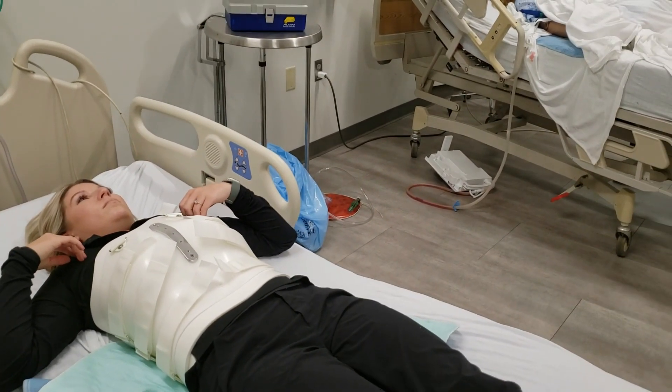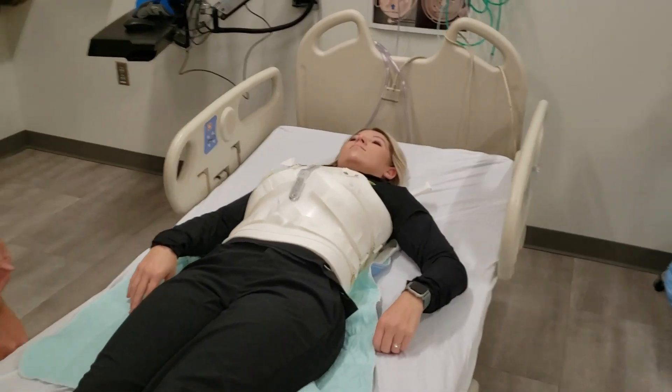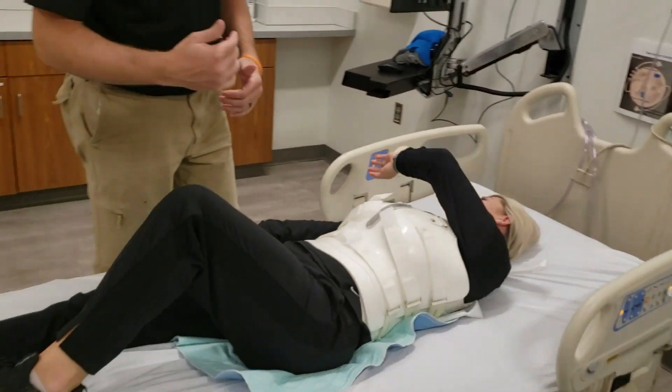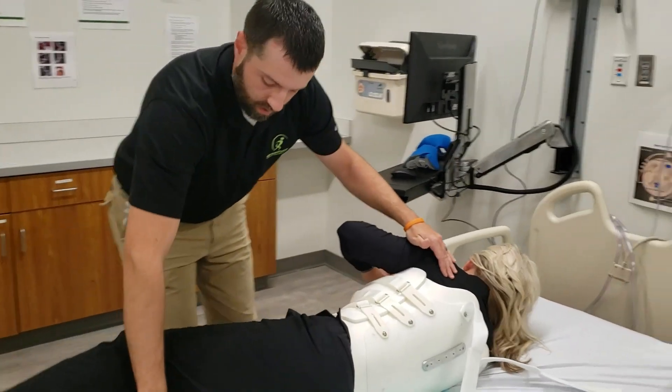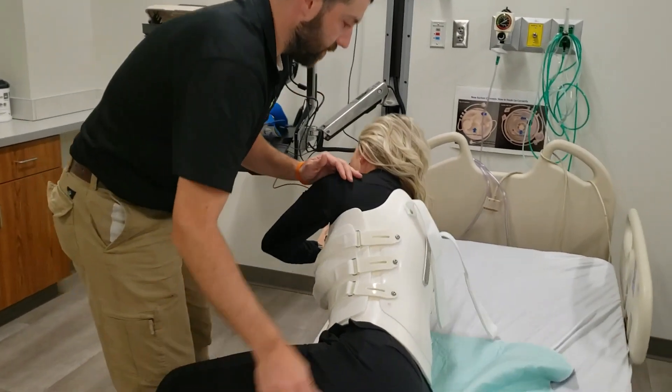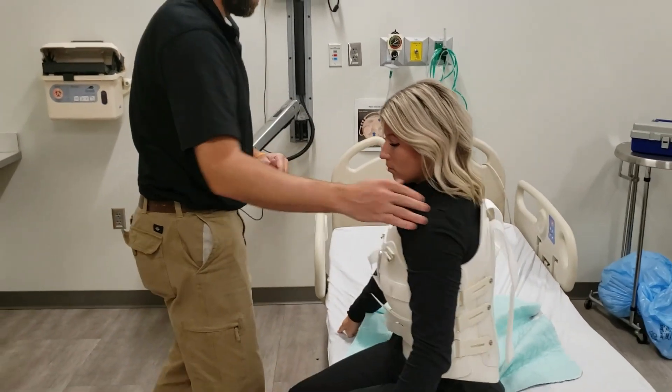Once that is fit, we will have the patient log roll again and sit to the edge of the bed — bending that knee, reaching across, keeping the hips and shoulders in alignment. Assist them in dropping a leg off. Make sure you let go of your left arm so you don't twist.